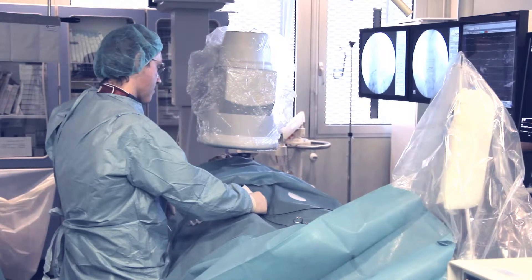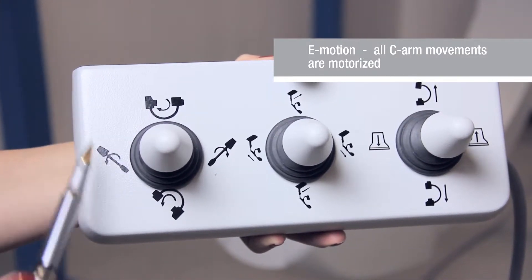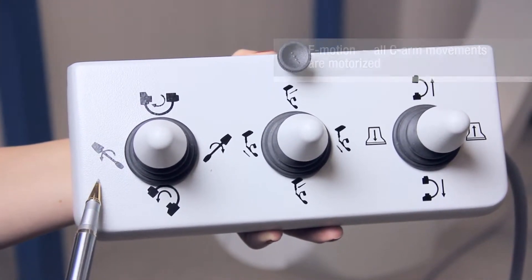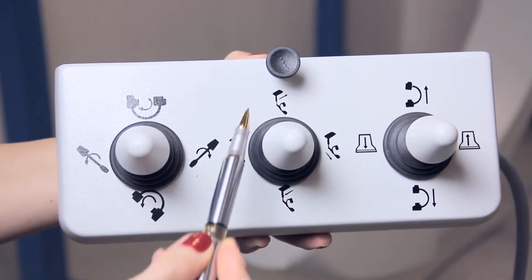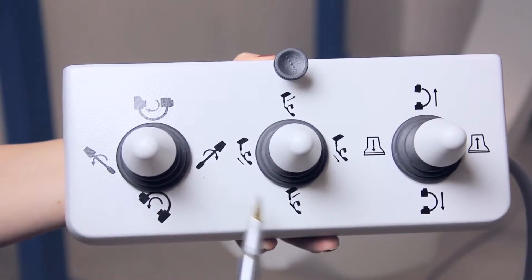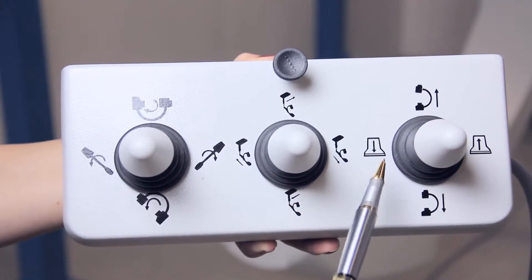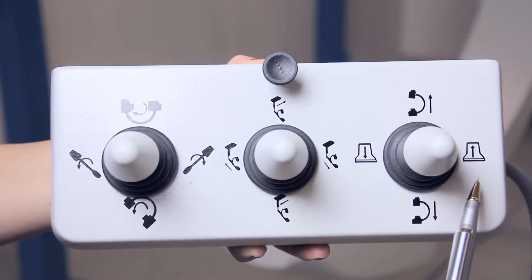An ergonomic control panel improves the working process. The simple and convenient control panel for the C-arm allows moving it in orbital and lateral directions. The second joystick moves the C-arm in the longitudinal and crosswise directions. The third joystick moves the image intensifier and the C-arm up and down.